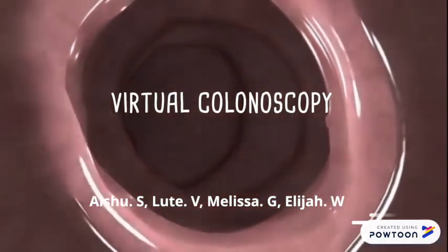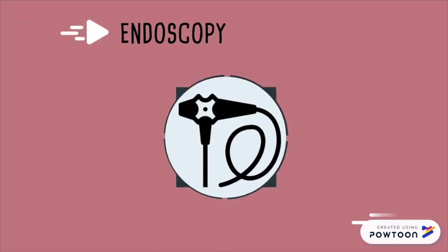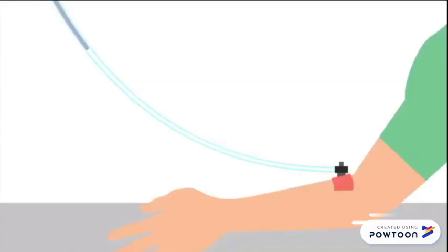Virtual colonoscopy, should it supplant the real thing? Endoscopy is a non-surgical medical procedure that allows a doctor to examine the inside of the body using an endoscope, which provides a direct view of internal organs. And for the focus of this presentation, we'll be looking at colonoscopy, which is the examination of the large intestine. Let's move on and have a look into what the process of conventional colonoscopy involves.